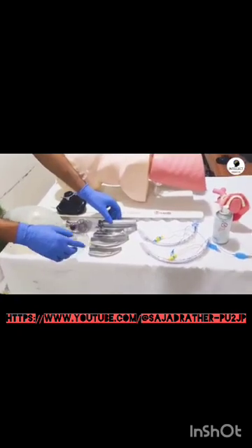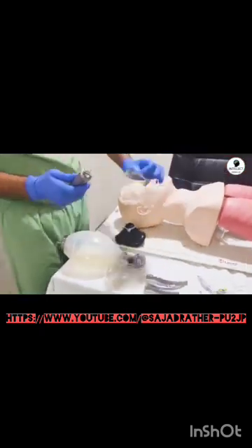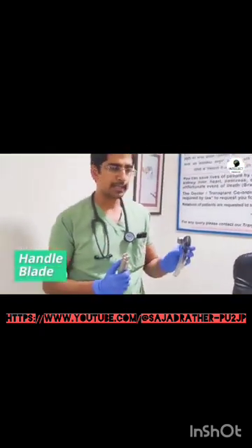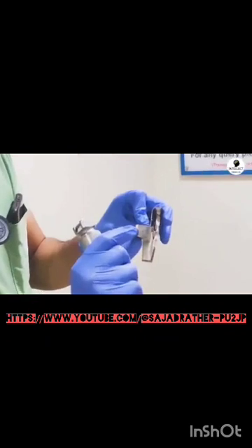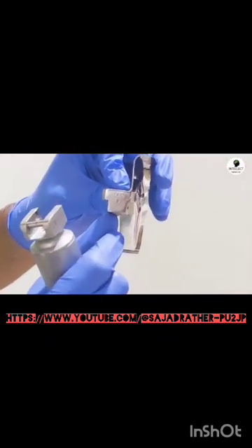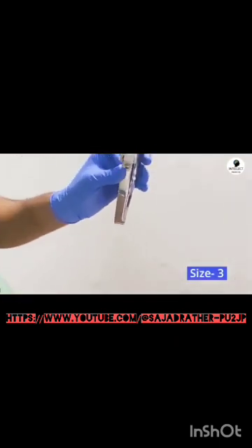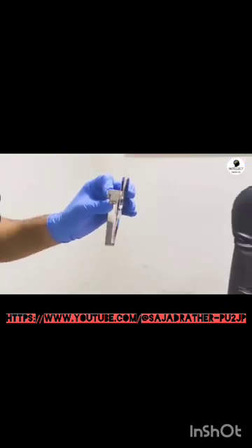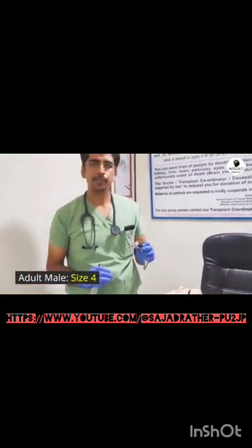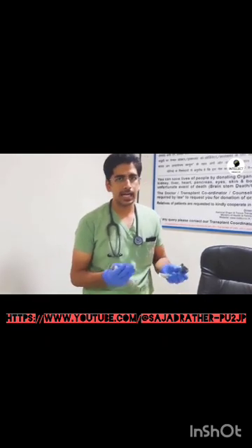These are different sizes of laryngoscope, mainly the Macintosh laryngoscope. Now I'll show you. This is the handle of a Macintosh and this is a blade. And you can see the sizes are written over here. Mac, size number 4. So there are different sizes. You can see size number 3 and the other is size number 2. So in an adult male patient, we prefer to use Macintosh size number 4, whereas in an adult female patient, we prefer to use size number 3. But then again, it depends on the anatomy of the patient.